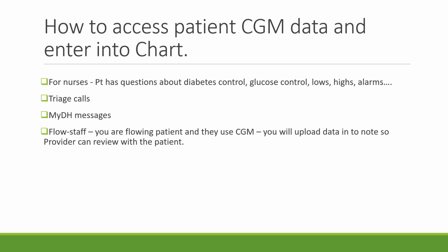And then for the flow staff, you're going to be uploading this data for patients with diabetes who are coming in for follow-up or for their physicals, and the provider needs this data to review with the patient to make decisions about their diabetes care.